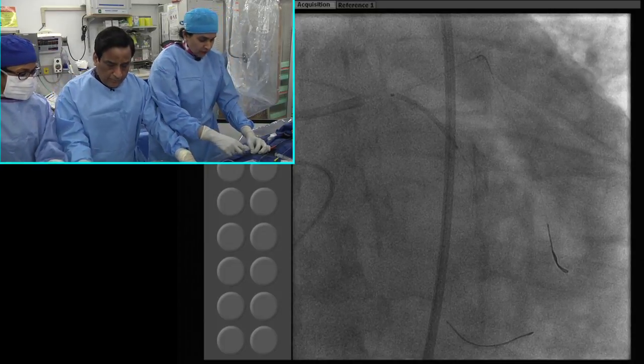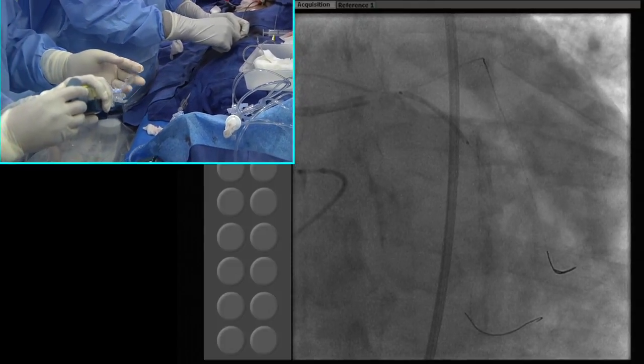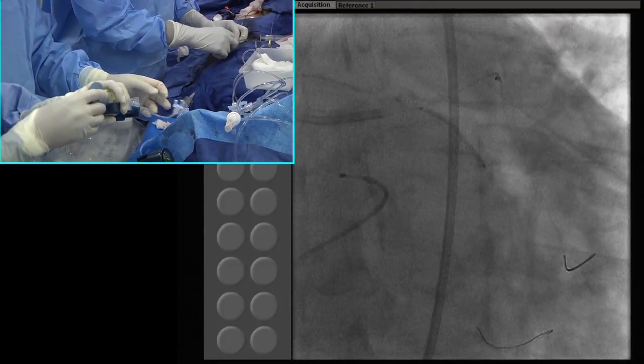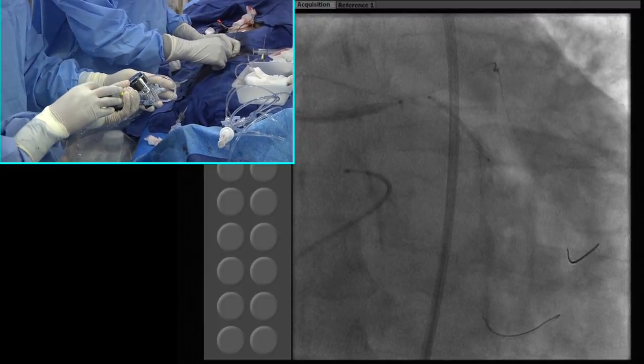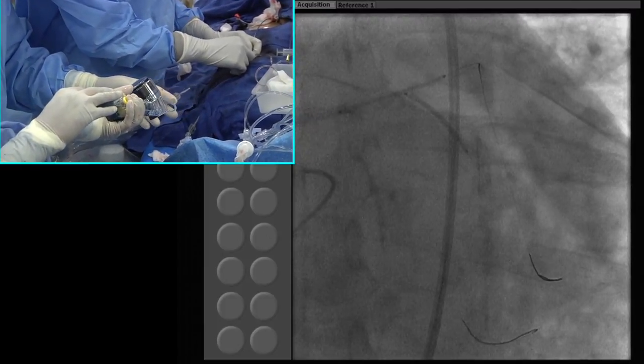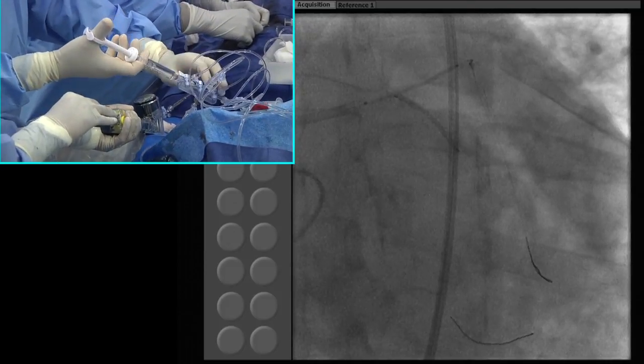And what balloons do you want post? Post, oh, you want to go to the circ with what? 2512 new balloon? No, 3012. 30 may go or may not? Yeah, 30 will go. Okay, good. Let's take a picture. Okay.